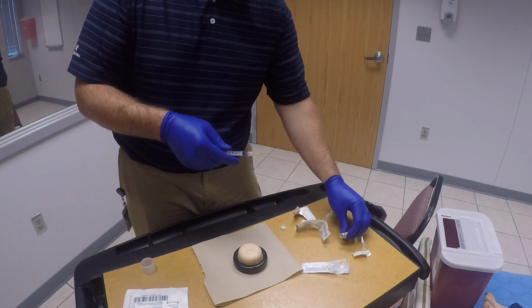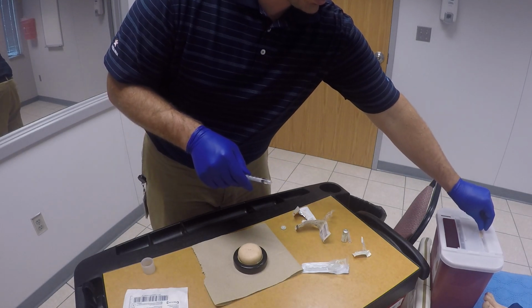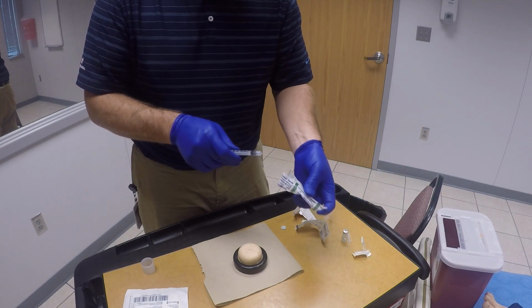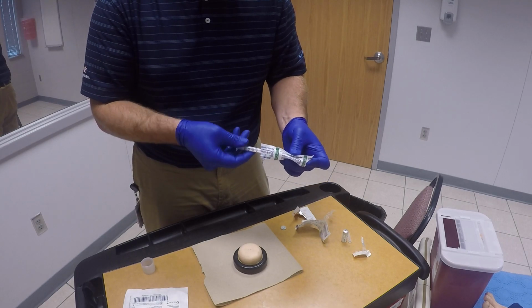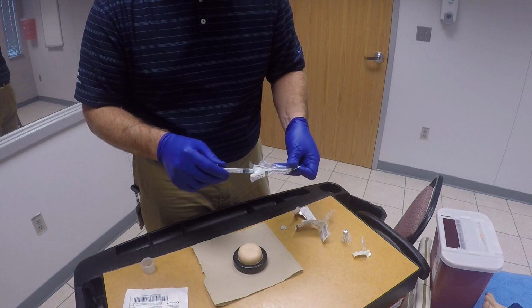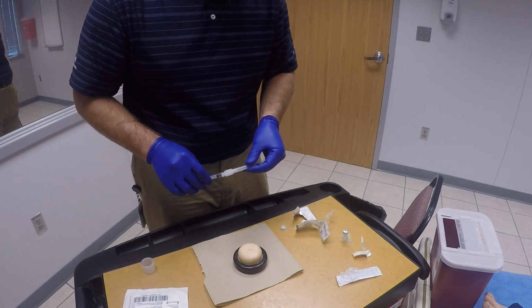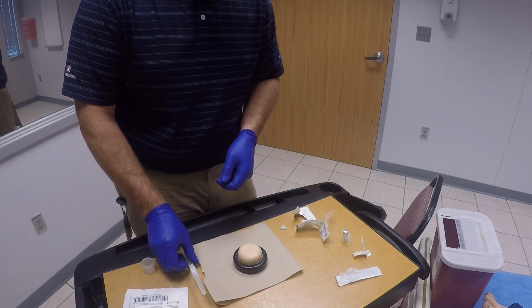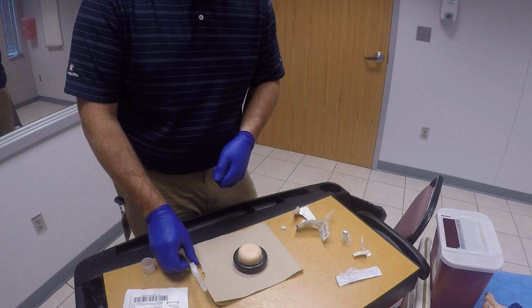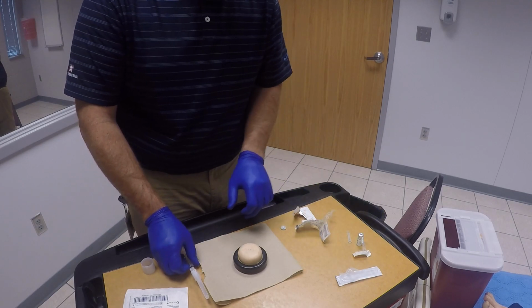We'll set that aside and make sure we have it for documentation. We can go ahead and dispose of that needle in a sharps container, and we'll get our needle that we're going to use for administering it to the patient. Go ahead and attach that to it. Maintaining cleanliness and sterility with all this as best we can. We'll go ahead and reconfirm that it is the right amount and right medication that we are wanting to give. We're going to give 1/2 milliliter of this.